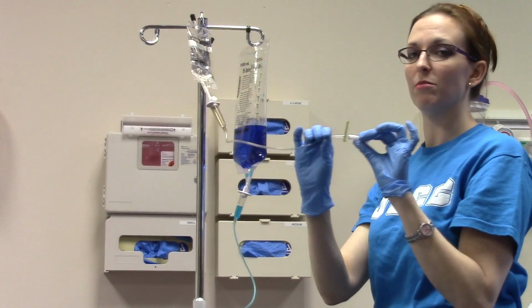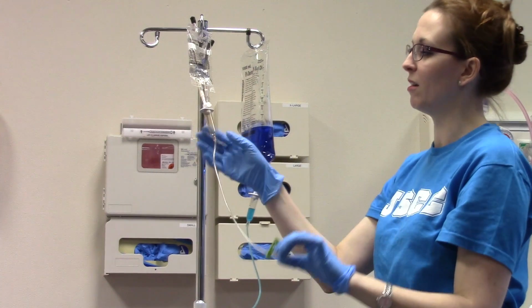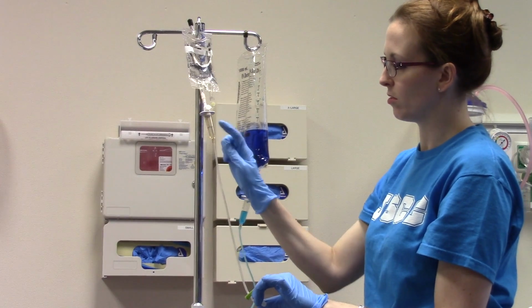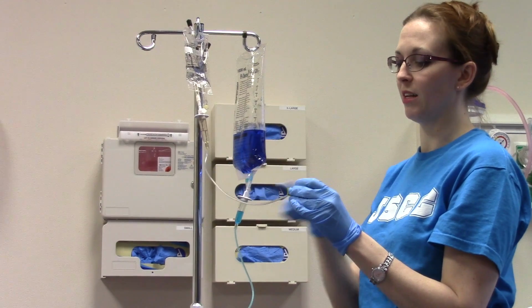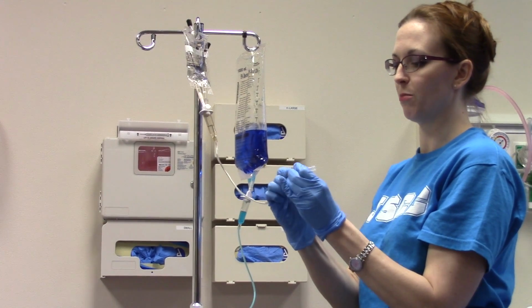Now since I clamped this, it's not going all over my shoes. If I forgot to unclamp it, it would go everywhere. So I'm going to do the same thing, just like I primed this. Fill the drip chamber to the line. And then unclamp for just a quick moment to let that prime out. And it's primed.